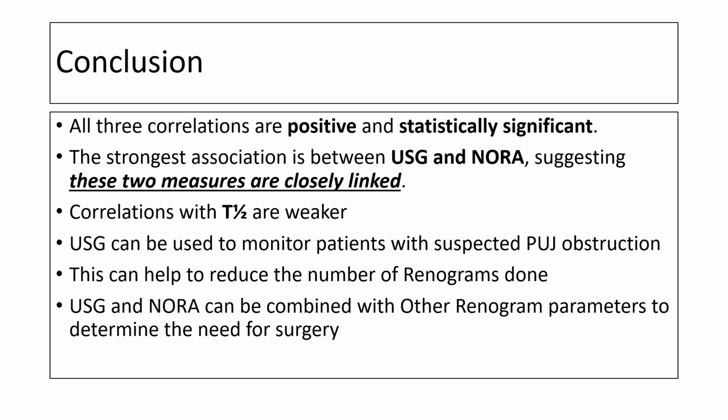Also, many of these patients who show good drainage on initial and subsequent ultrasounds can be monitored only by sonography, and importantly, sonography and NORA can be combined along with other parameters on renogram like the CTT, that is the cortical transit time, to determine the need for surgery before any irreversible damage to the kidneys sets in.